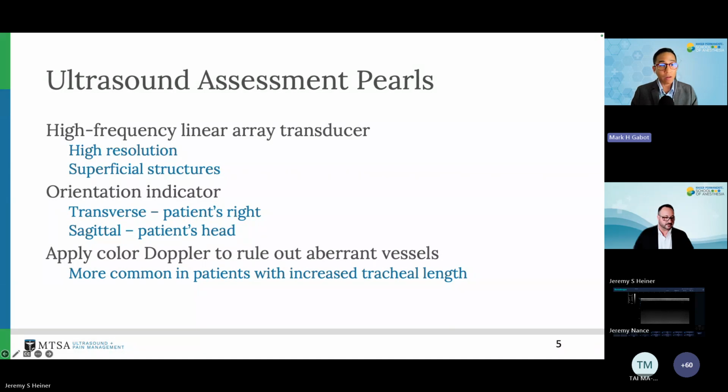So it's important for us to identify where the cricothyroid membrane is. Now, in most situations, we would be able to palpate it just with our fingertips. But in patients that are anticipated difficult airways, we may be unable to palpate it because of obesity, or maybe they have some sort of abnormal anatomy where we just can't palpate and identify where the CTM actually would lie.